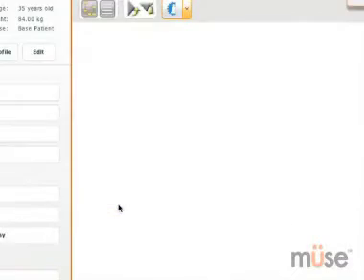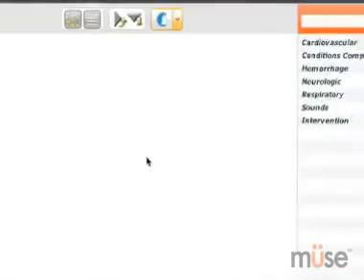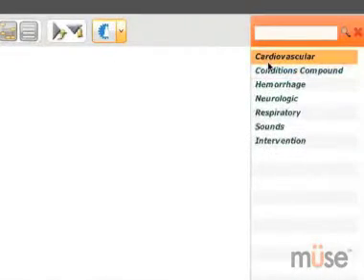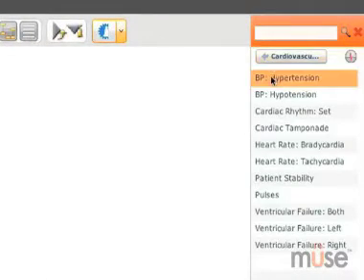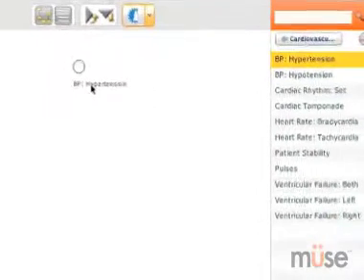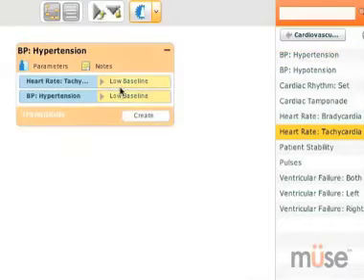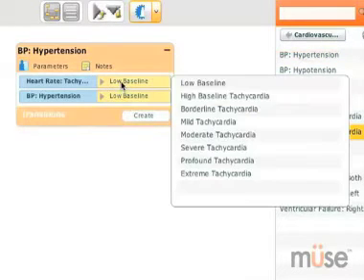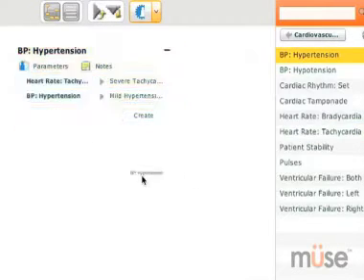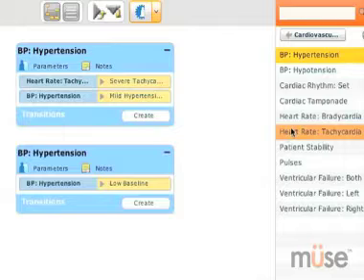MUSE makes designing a scenario from scratch easy, too. Using MUSE's Scenario Designer, you can build your own scenarios graphically on the screen in front of you with drag-and-drop simplicity.